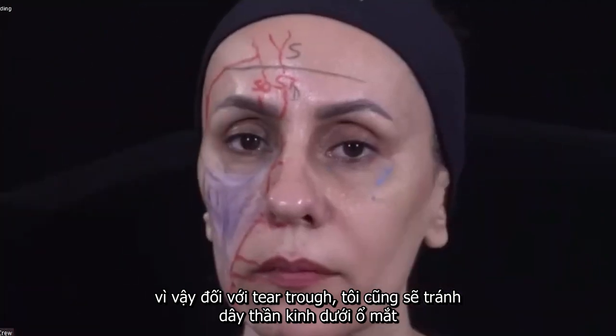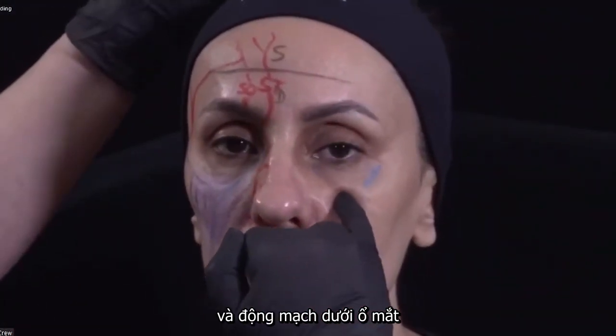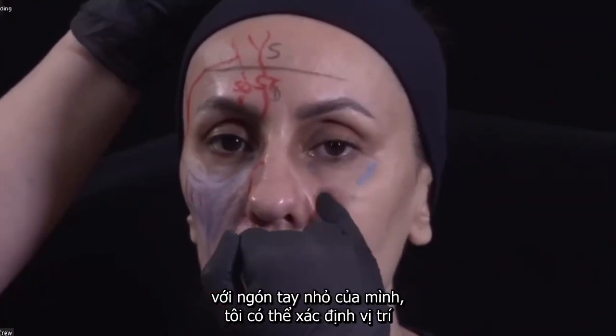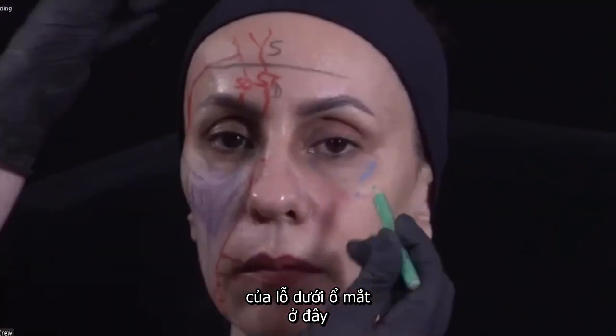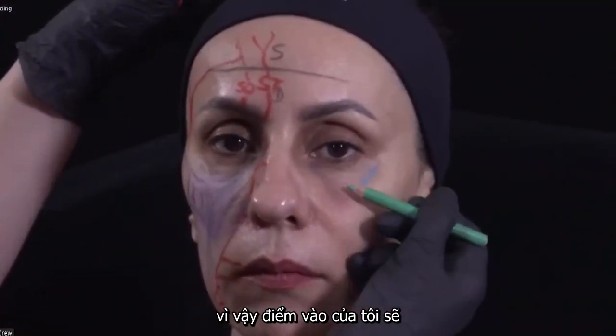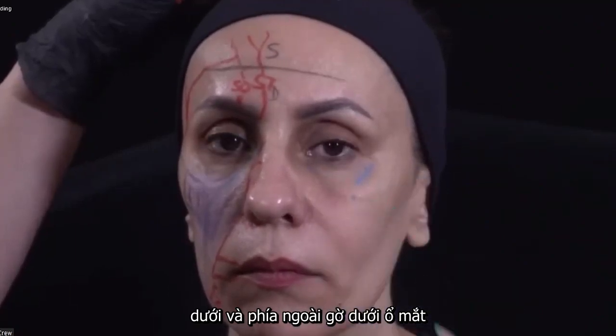For the T-trough, I will also be avoiding the infraorbital nerve and the infraorbital artery. With my small finger, I can locate the infraorbital foramen here. So my entry point will be down, lateral and away from this infraorbital nerve.